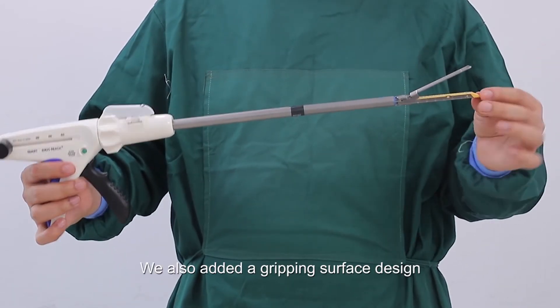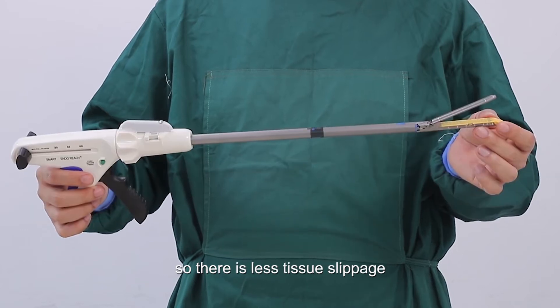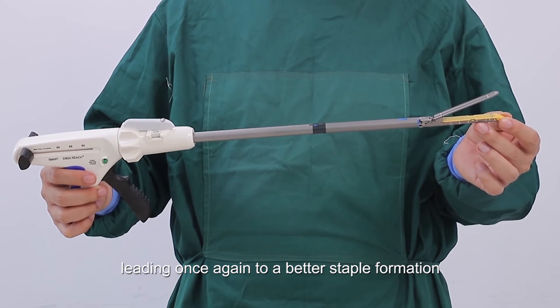We also added a gripping surface design, which increases the surface friction between the tissue and the reload during firing, so there is less tissue slippage, leading once again to better staple formation.